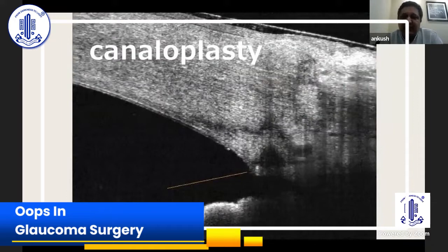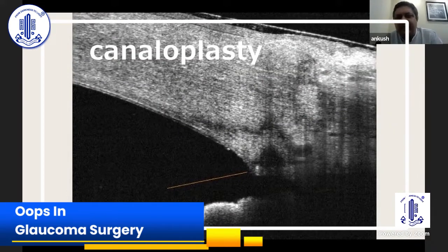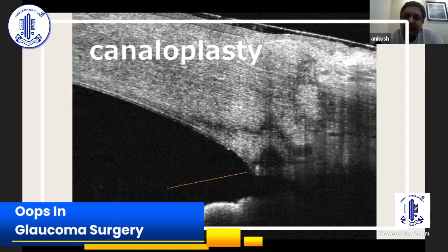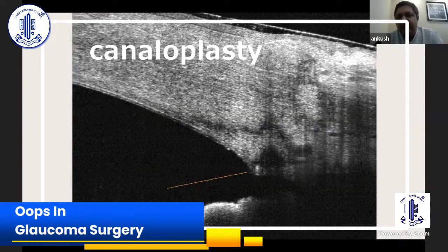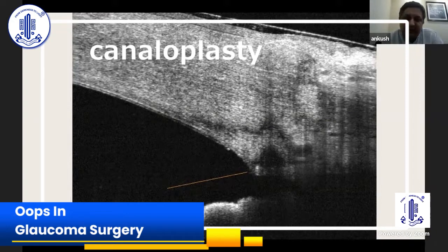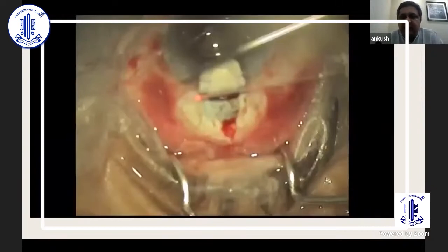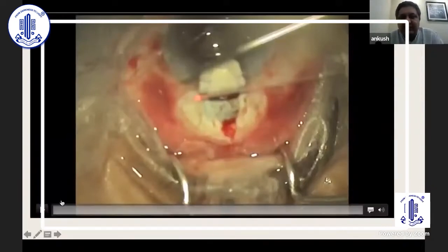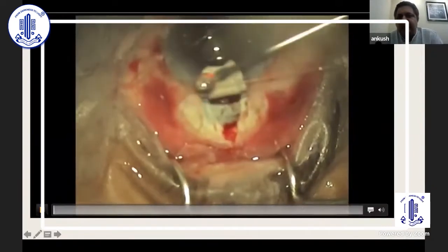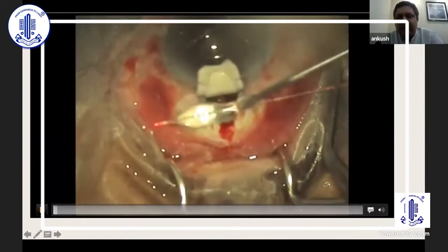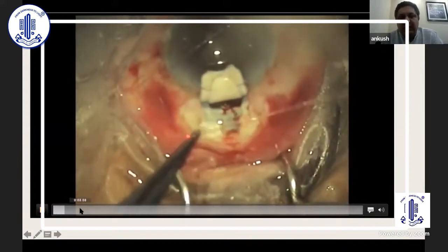First we'll take up canaloplasty. Canaloplasty is not a very difficult surgery — it's a simple surgery. The basic premise is you open up the Schlemm's canal, put a suture inside, and tie up the suture tightly using a catheter which helps you guide through the canal. The basic problem which people have while doing the surgery is cannulation of the canal. This is a simple surgery just to show how to cannulate the canal and where all you can go wrong.